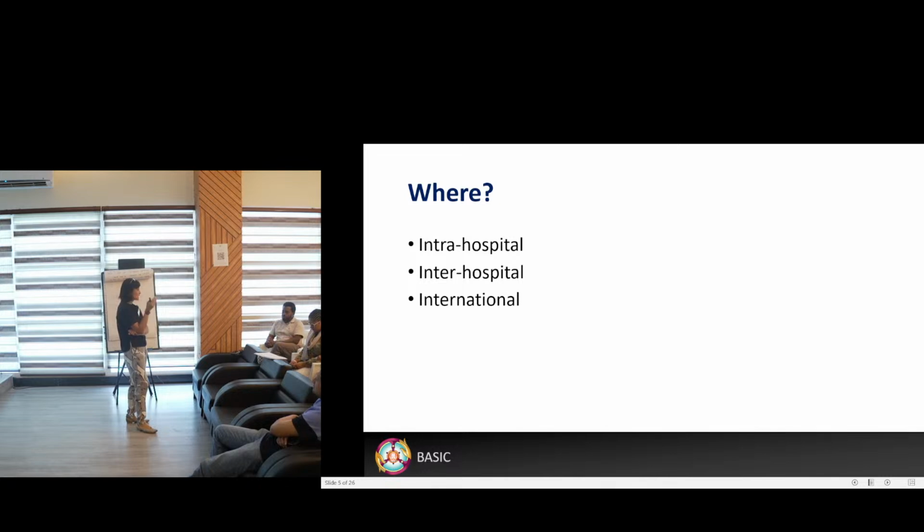Do you take cylinders? How do you normally take oxygen? Cylinders. So how many cylinders? Small cylinders, isn't it? Yeah, we only have the little ones. You're going to take 1 full one? 1 big one? Okay, all right. Yeah, I mean, I take 2 little ones. If they're on 50% and above, I obviously will take 2 cylinders, and they have to be full. But only because I know where my CT scanner is, and I know that when I get to CT, I can plug into the wall there. So I keep my cylinder just for transport.